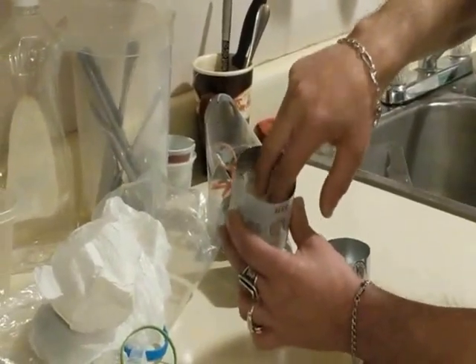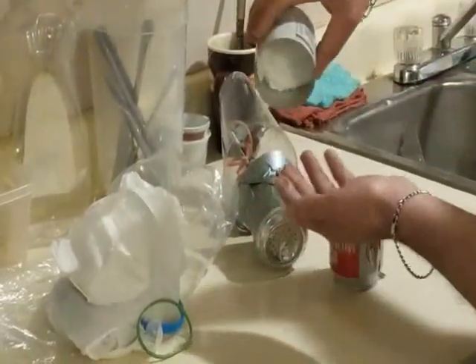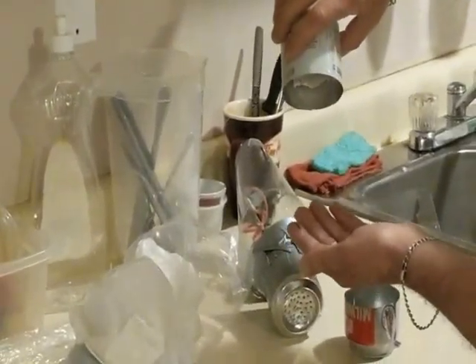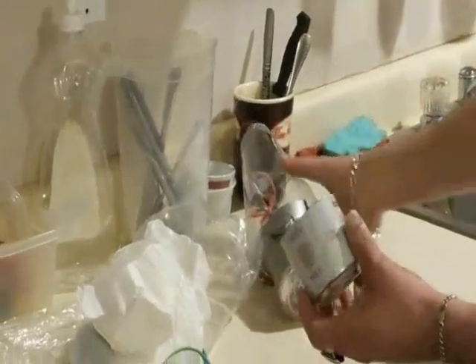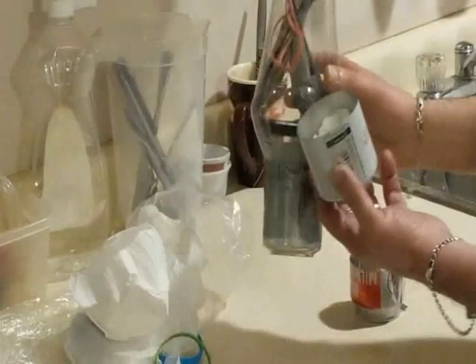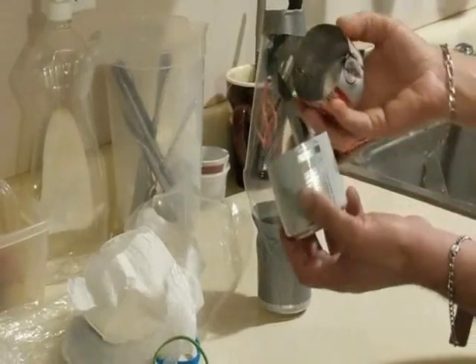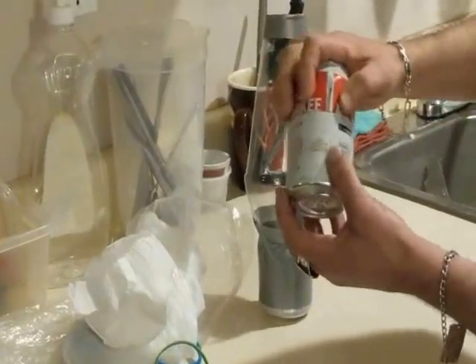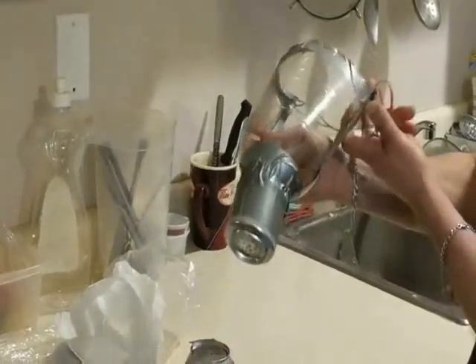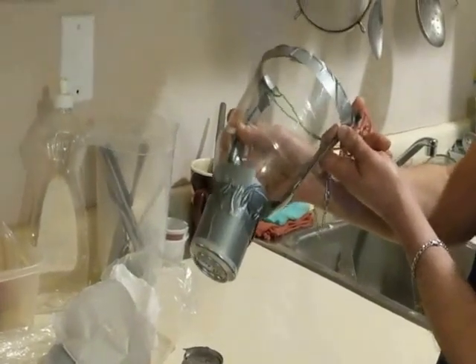As you see, I'm putting it in there firmly. That way none of the activated charcoal will fall out as I'm tipping it upside down. You will not have that problem because you will be wearing your mask and it'll be on your face. And remember, it gets taped to the mask with duct tape. It's exactly the same as what I'm showing you. You can make several of them and store them away. And there you will have the best filtration mask that you can make.